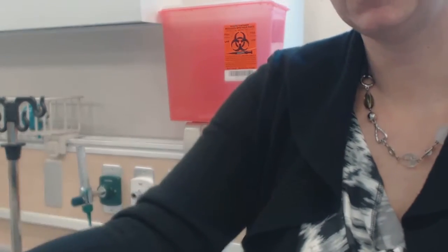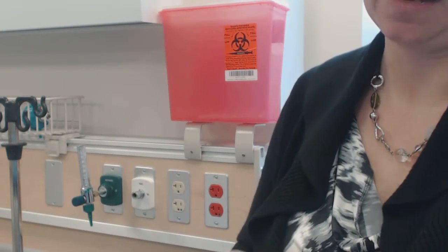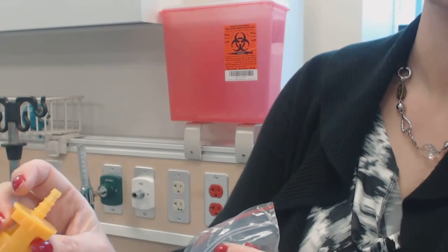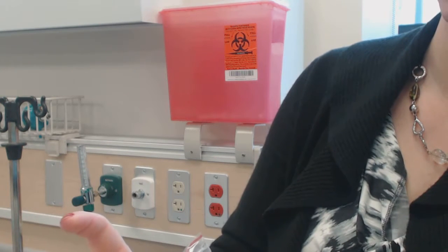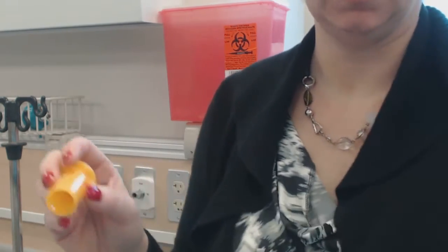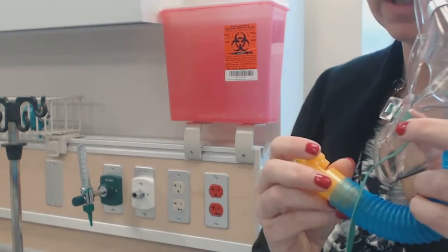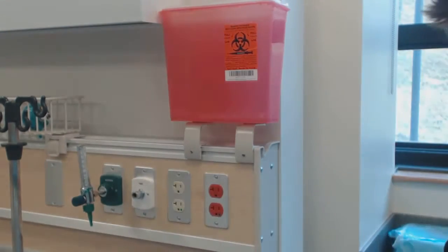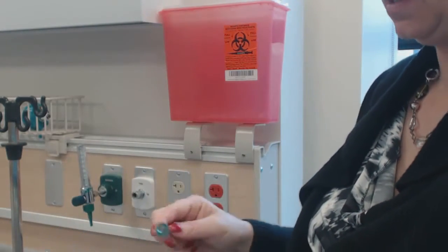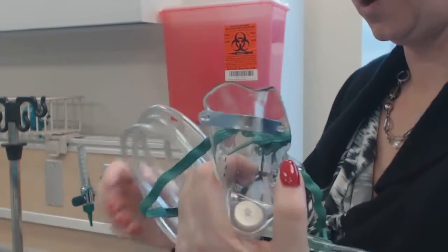If the patient still isn't maintaining and my orders are to titrate to keep oxygen saturation at 90%, I might have to use all of my attachments. This one is going to be 50% at 8 liters. So after 50% — after this orange one — I know that I'm having a bit of a problem and I might have to switch to my non-rebreather.